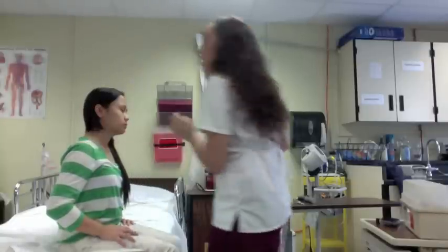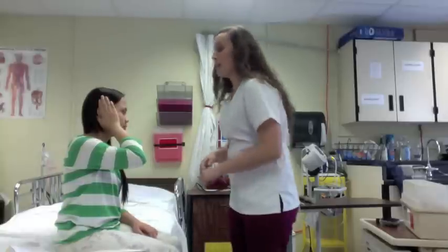I can also use an otoscope to check her tympanic membrane. Next, we are going to check for auditory acuity. And first, I'll use the whisper test, in which I stand to Karen's side and have her cover her opposite ear and have her repeat what I whispered. Baseball. Good. And you should do this test in both ears.